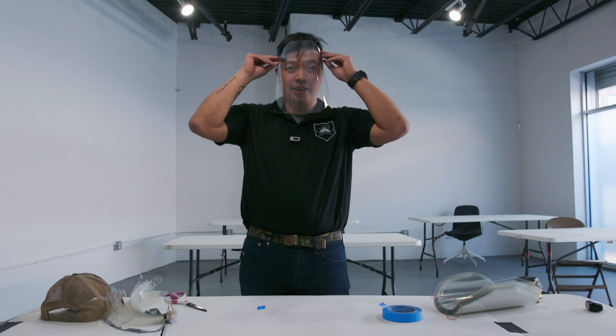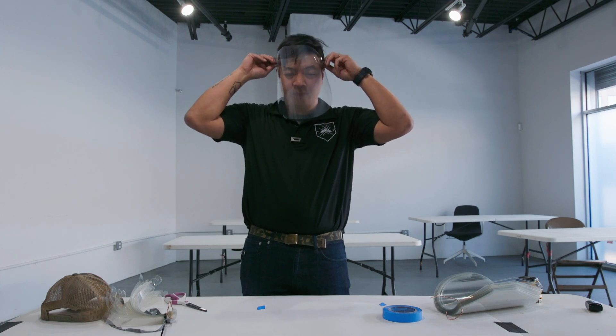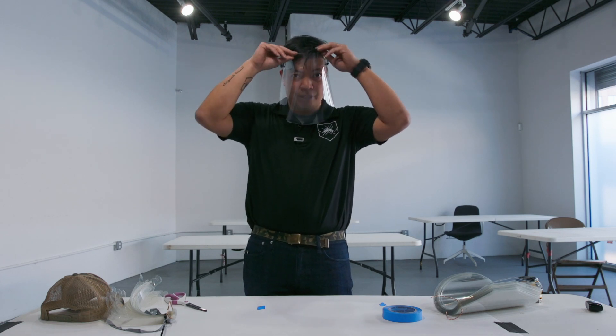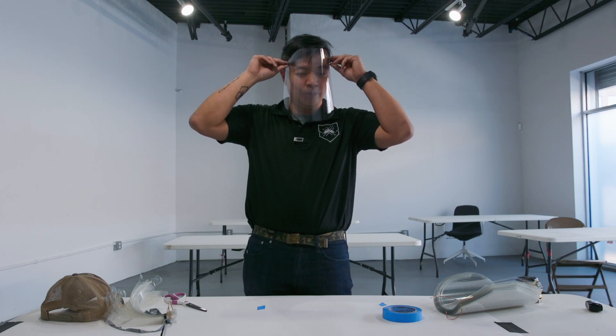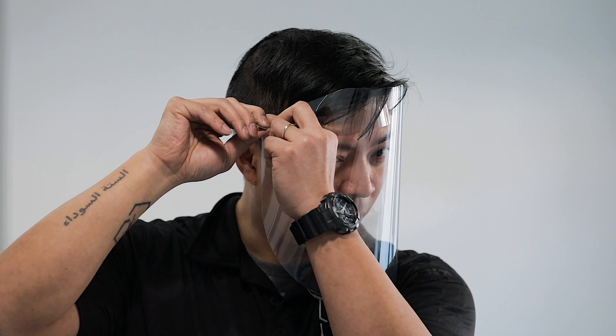It goes onto the head like this. Now if you're a user and the face shield is a little too loose, you can always pull on these elastic parts and it'll tighten it up. And that's how you make these improvised face shields.